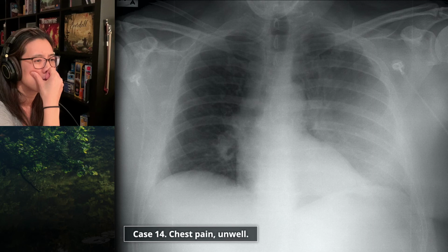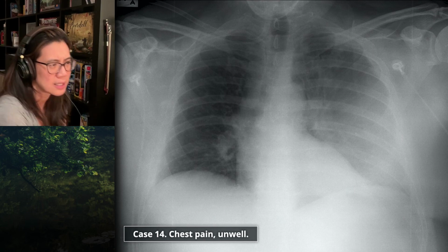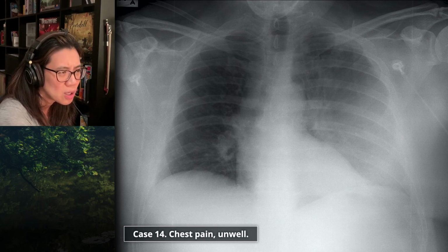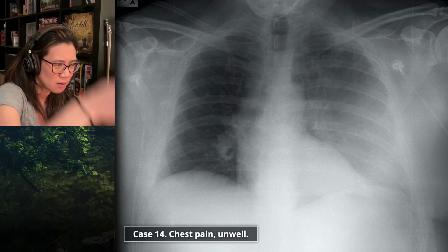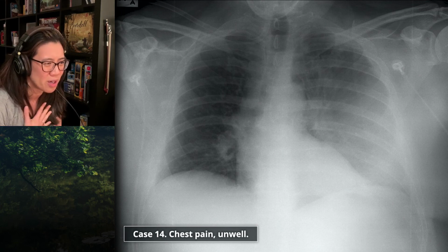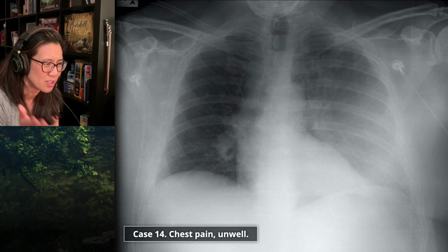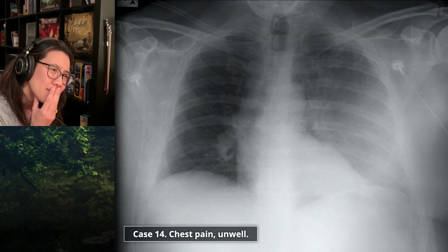Yeah. So they thought he might have had an aortic dissection. He had tearing chest pain through to his back, and they thought it could have been aortic dissection. So really the only part of the aorta that I see very clearly is the aortic arch. I don't really see the descending thoracic aorta well, but it's not a great film, so I'm not sure that I'd feel comfortable to say that it's abnormal. I'm not certain. So they sent him round for a CT of the chest.